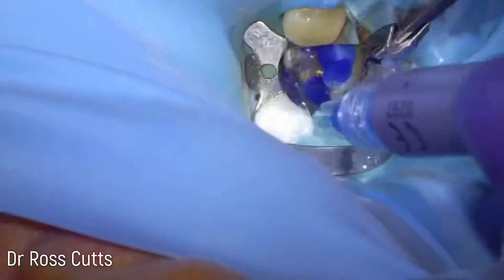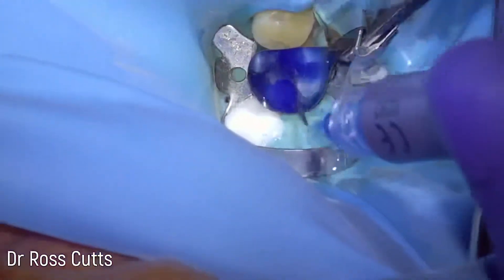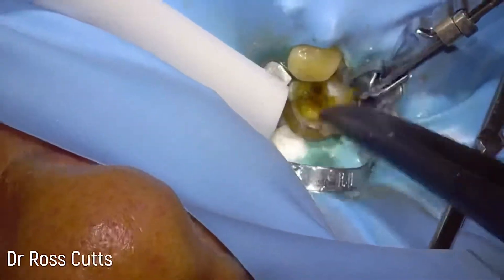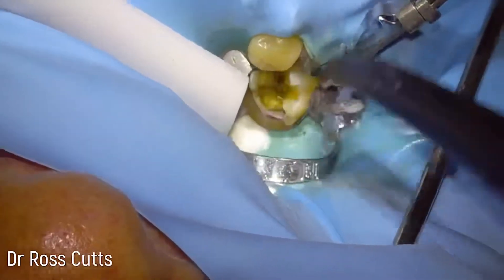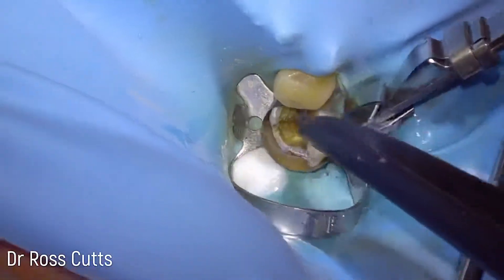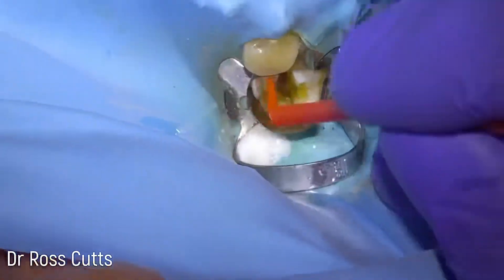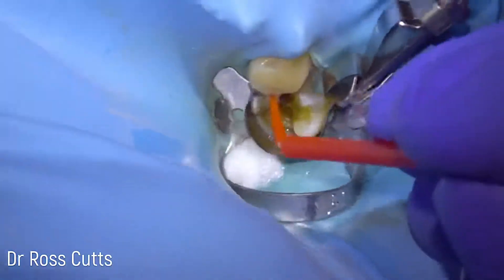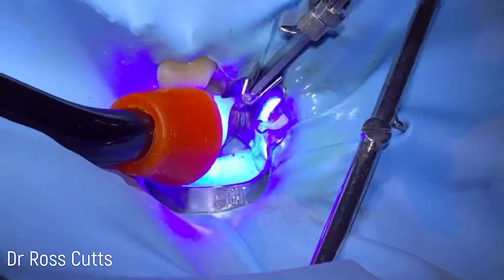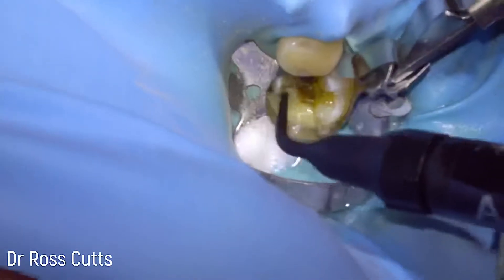Then we start by etching the tooth for 20 to 30 seconds all over the enamel surfaces, and then we wash it off and dry it. We get that beautiful frosted appearance.